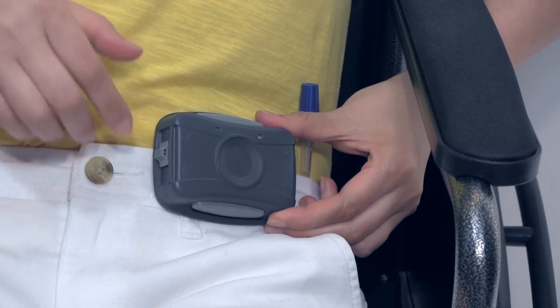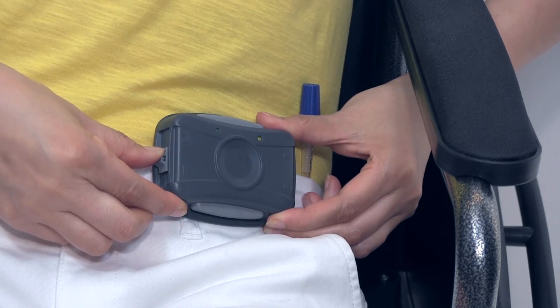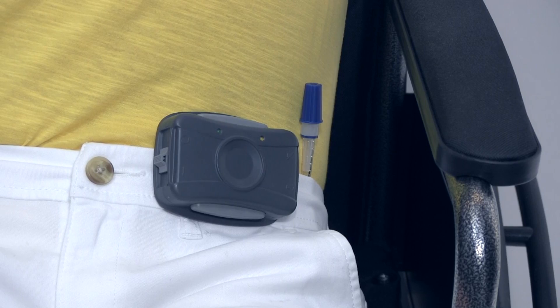Now, turn on the controller. The controller will vibrate briefly and both lights will blink when switched on.